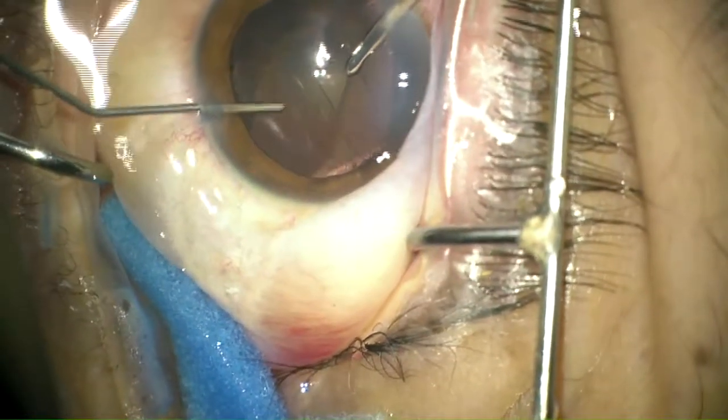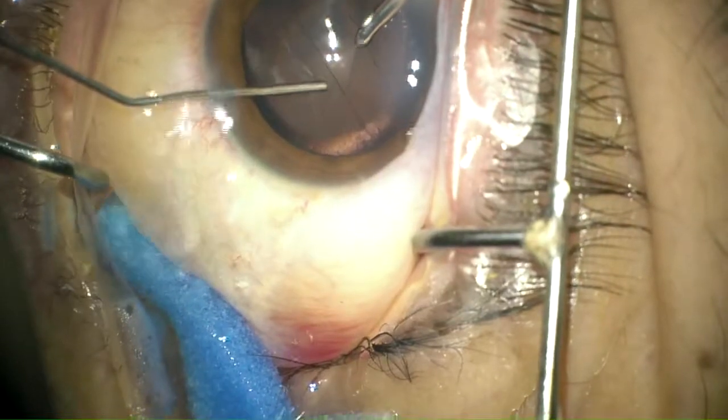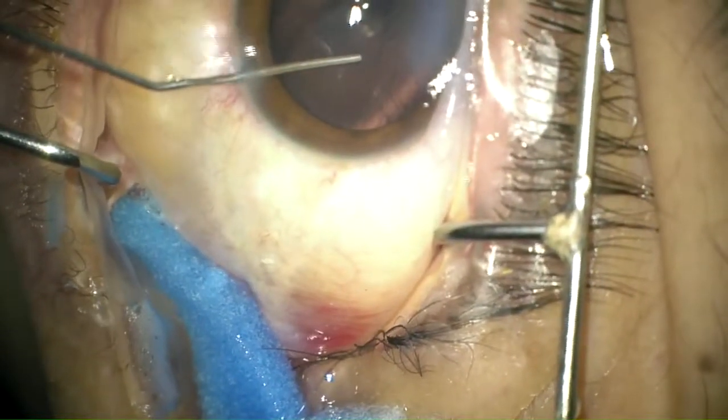Again, you can notice that we are injecting viscoelastic substance before going out with the irrigating cannula, maintaining the anterior chamber.